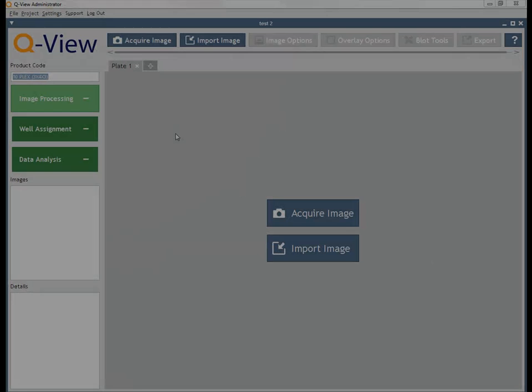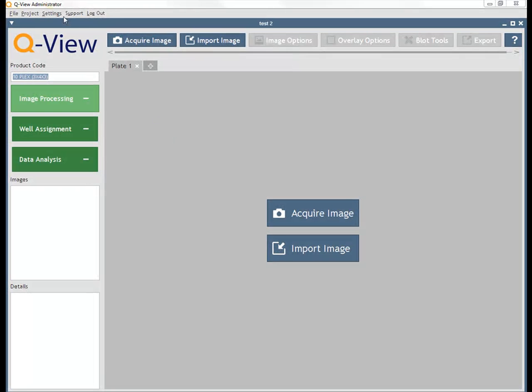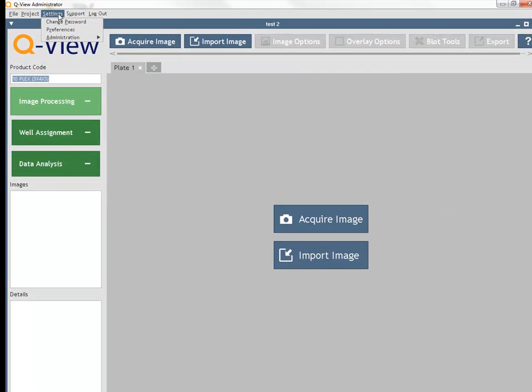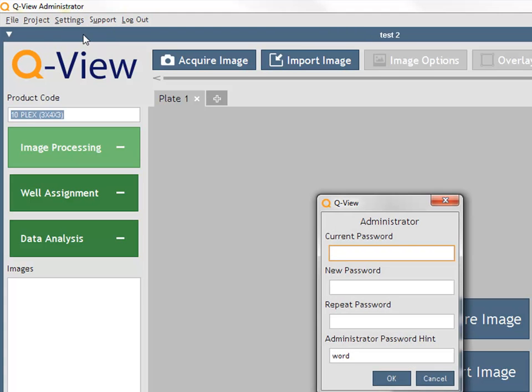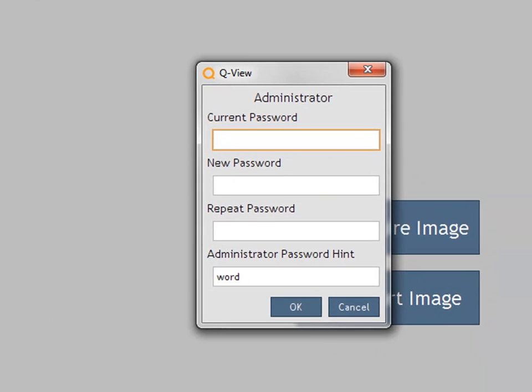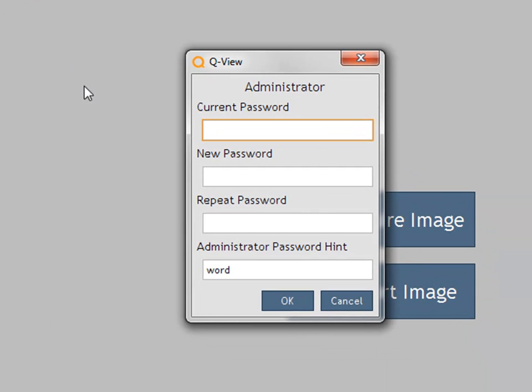From the project home screen, click on Settings. The Change Password setting allows the currently logged in user to change his or her password.